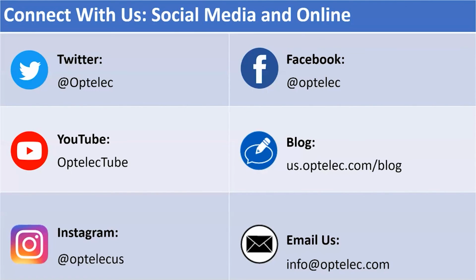Go ahead, Mike. Oh no, I was going to say, it's got pretty much all the same functionality. You can add that reading stand onto that as well, as an option. That's right, and that simplifies reading larger pages. But you've got your OCR, you've got your Bluetooth, Mirrorcast, all that stuff built into that unit too. I'll say again, I don't think there's one silver bullet that will do everything for everyone, but the Compact 10 is certainly a step closer.